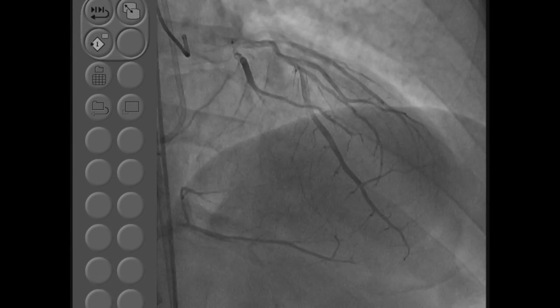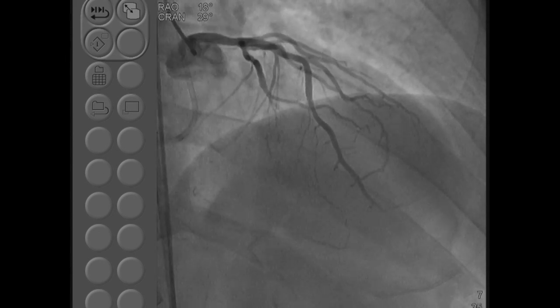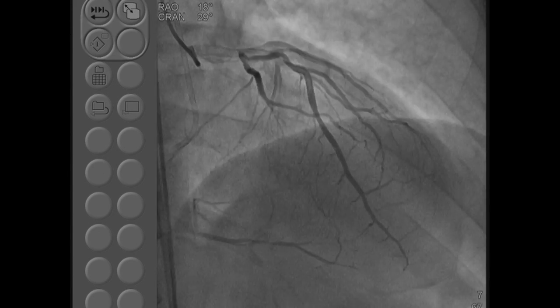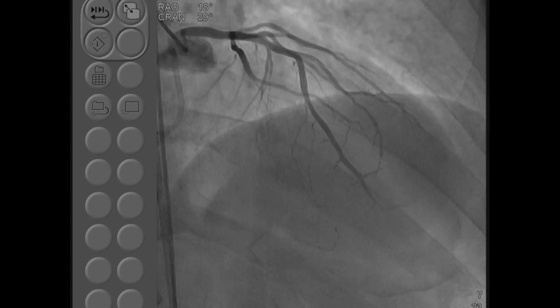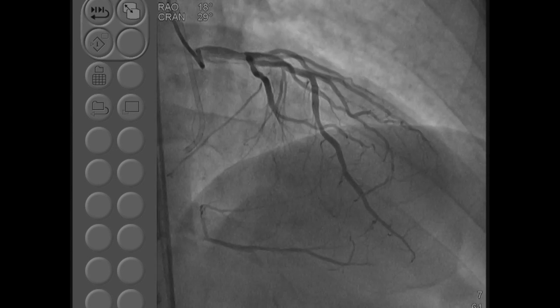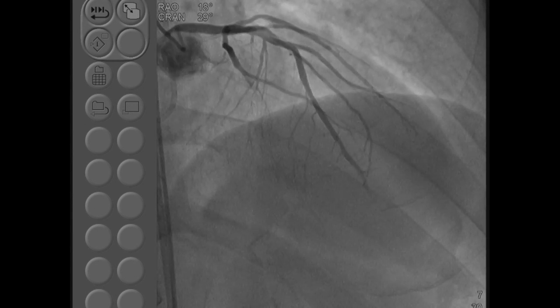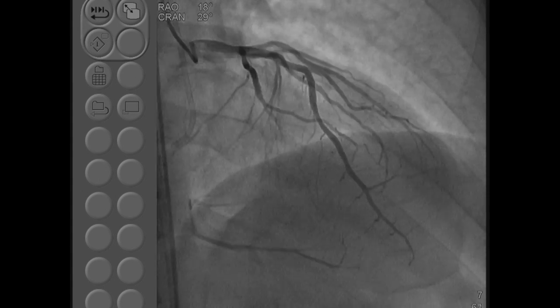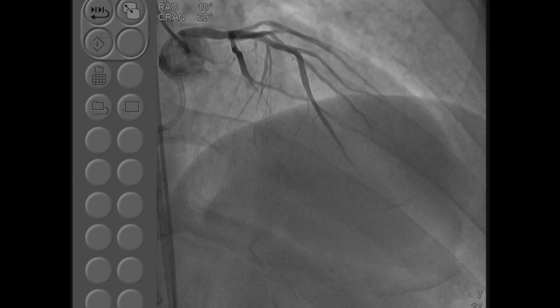Although it's never easy or definite to predict whether you are able to cross antegrade, this looks like a fairly good antegrade case. Yes, definitely. And clearly, to those who are big believers of the retrograde, I say that there is nothing magic about retrograde. You should know it. So in cases where antegrade is unsuccessful, you can do it retrograde.